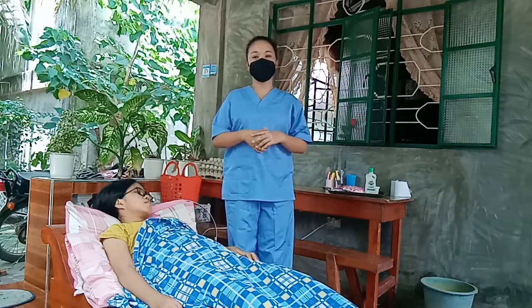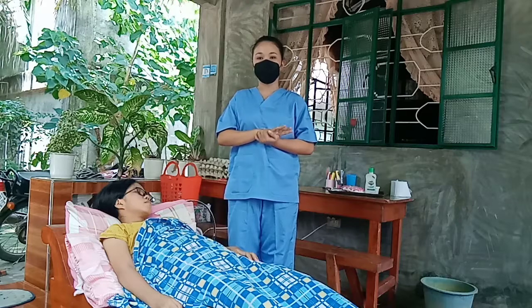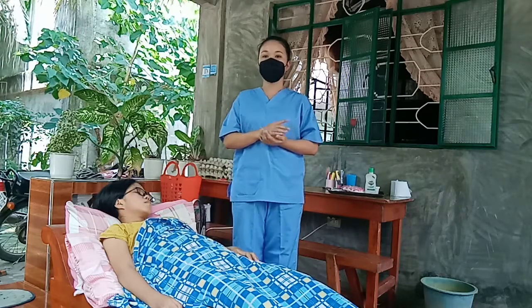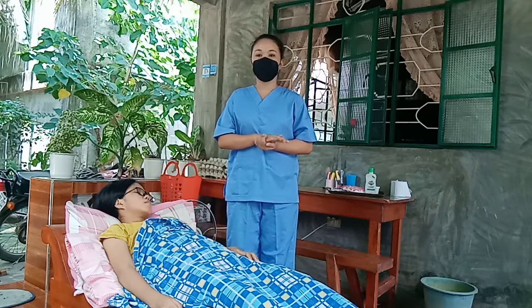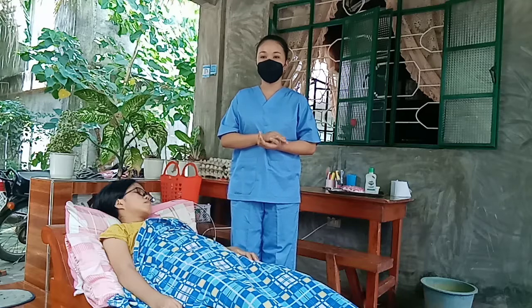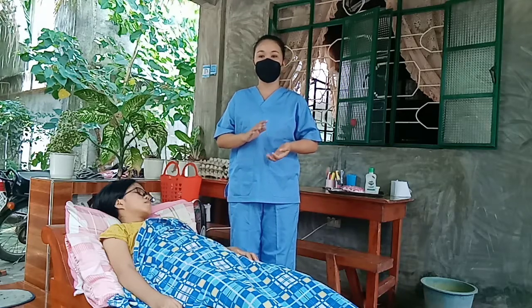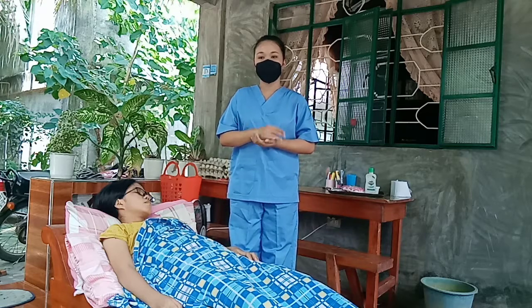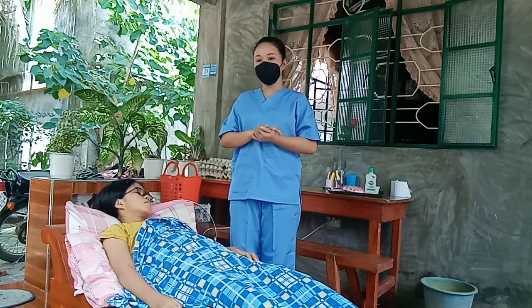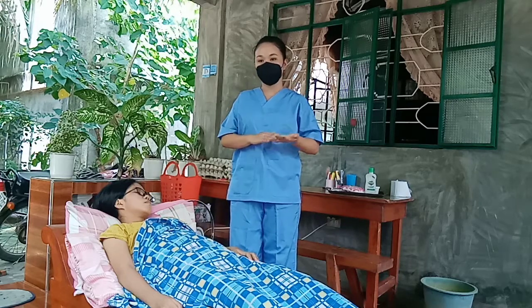Then next is evaluation. Number 1 is inspect the clean voided specimen for contamination. Number 2 is evaluate patient urine culture report for bacterial growth. Then number 3 is observe urinary drainage system to ensure it is intact and patent. Then number 4 is ask patient to explain steps of the procedure. Then number 5 is identify unexpected outcomes.